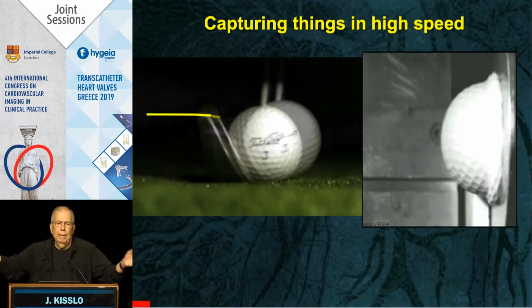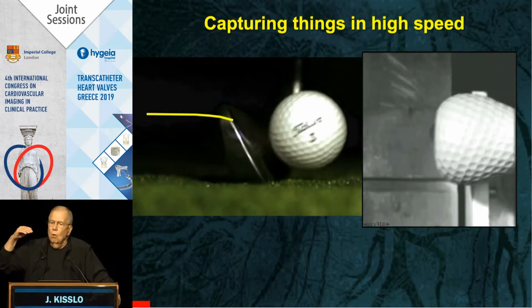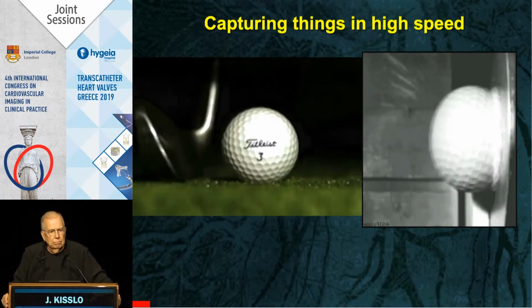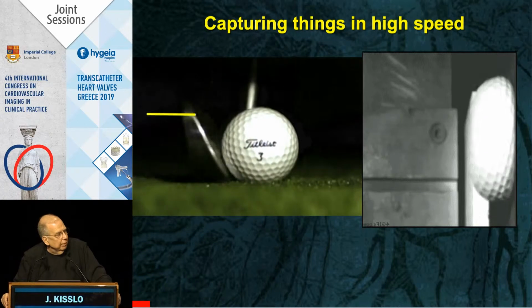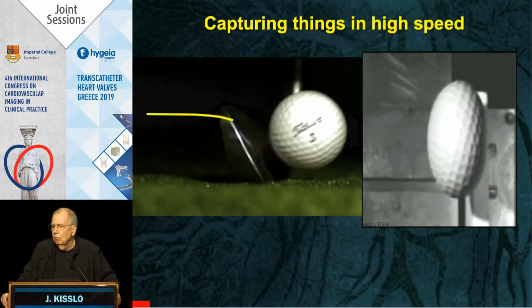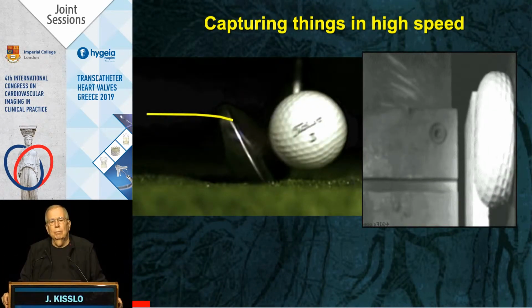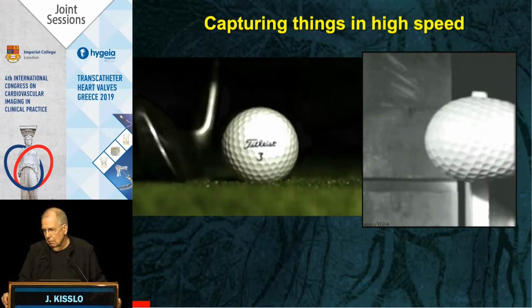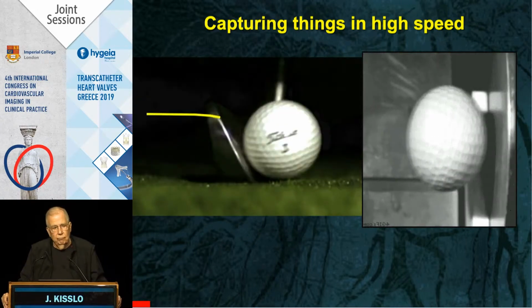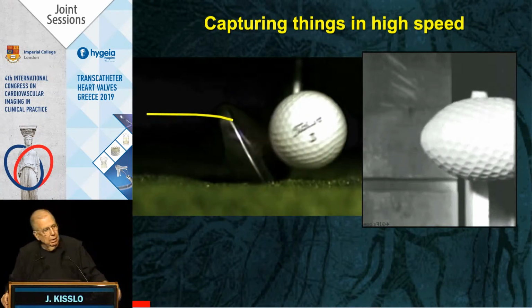A design of this and a design of that, getting into problems with heart block and the conducting system. And let me make this rapid transition into the fact that we will be using these same techniques now to image the conducting system. So when you use TAVRs and you use reconstructive techniques on tricuspid valves, where you're very close to the conducting system, you will be able to see the conducting system. And this will be a part, I believe, of every transcatheter valve implantation or procedure or modification that exists.